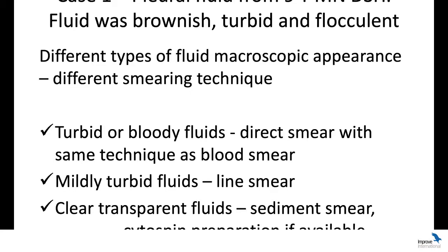And remember that even if you are sending the fluids to an external lab, it is worth doing that smear fresh, to send along with the fluid for the external lab, because as I mentioned during our time together, there are a lot of changes that can happen once the fluid is outside the animal that may mimic disease. So it's important to do that fresh smear. For turbid or bloody fluids, we do a direct smear, same technique as you would for a blood smear.